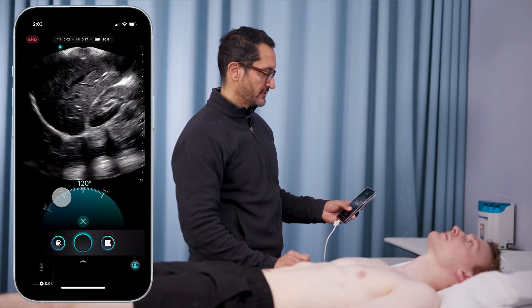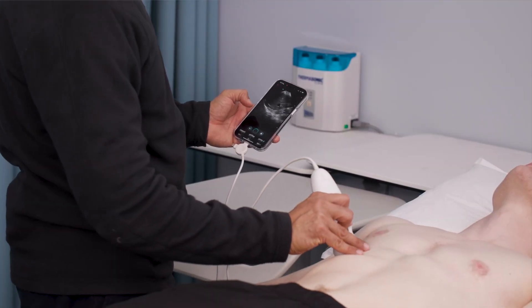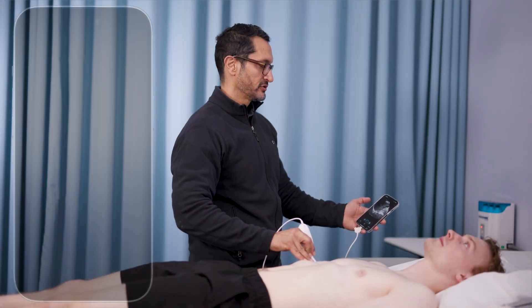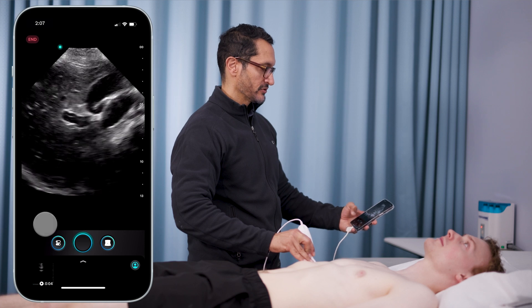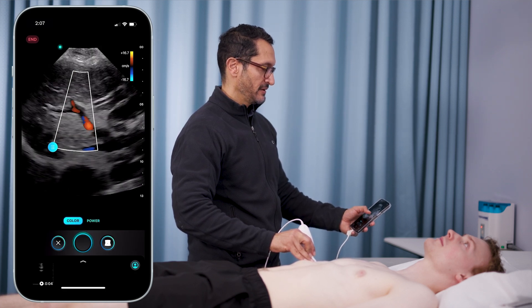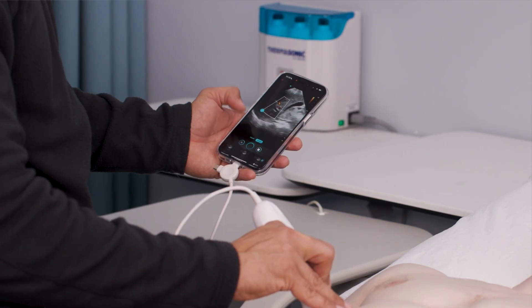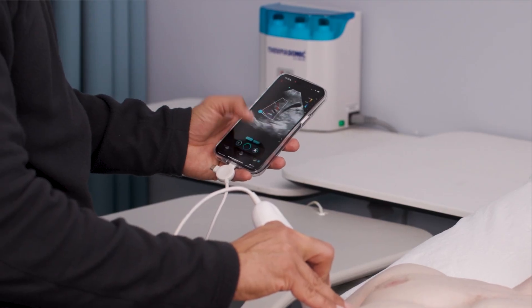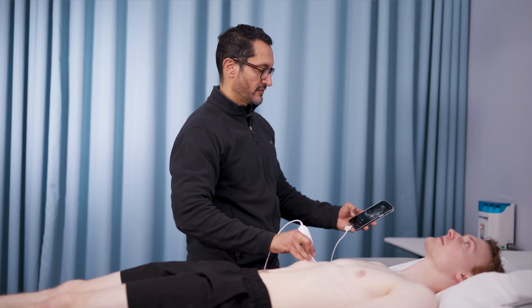I'm going to go back to 90 degrees, then quickly look at his gallbladder. Super clear — I change my depth, really look at that neck of the gallbladder, and you can see the portal circulation. You can hit color again, just pop it on to make sure you're looking at the vasculature. I can change it to power and color — beautiful imaging in your hand with one touch of a button.